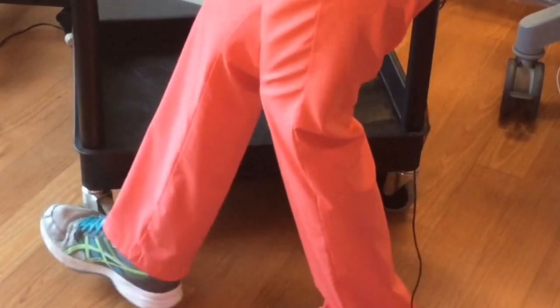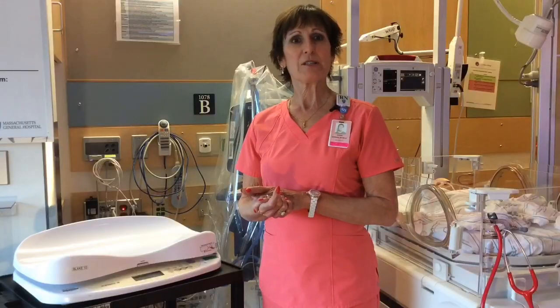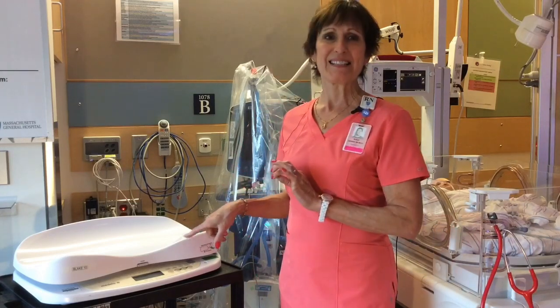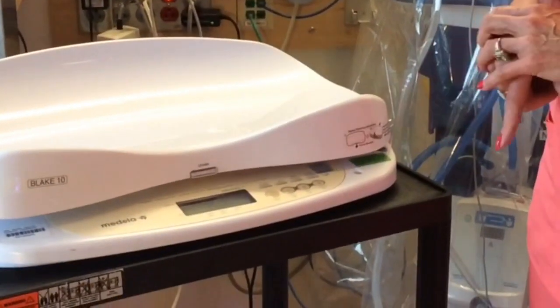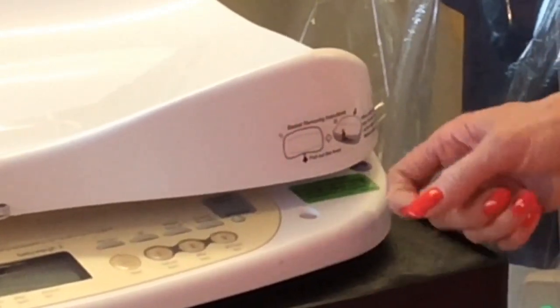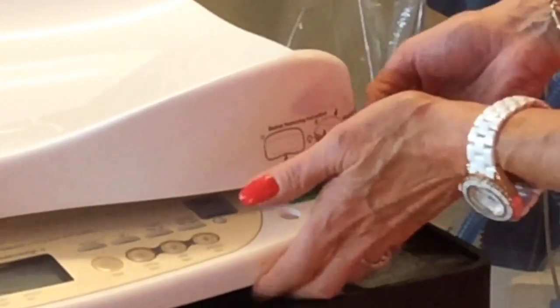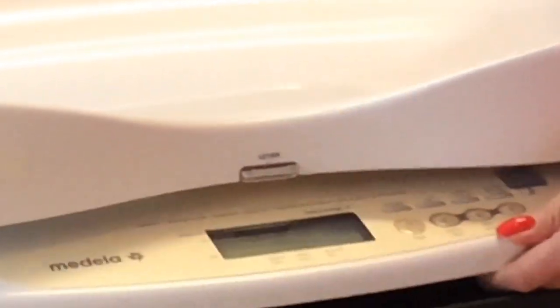Before you do anything, you need to lock the wheels on the cart so that you have a stable base that doesn't wobble. First, you want to turn the scale on and level the scale using the bubble gauge, which is right here. The bubble needs to be in the center of the red circle in the bubble gauge. Use the adjusters on the bottom of the scale to keep the bubble centered. The adjusters are these legs.